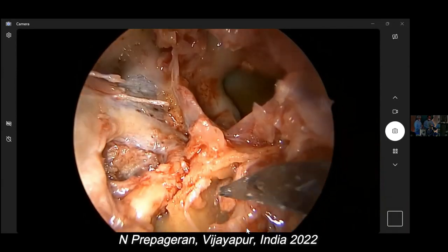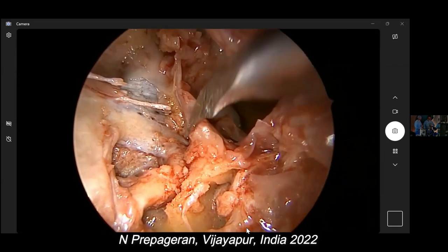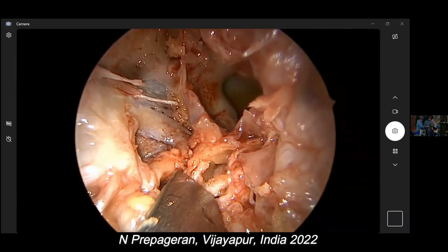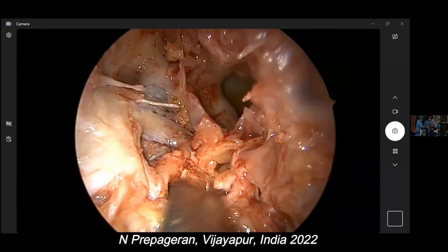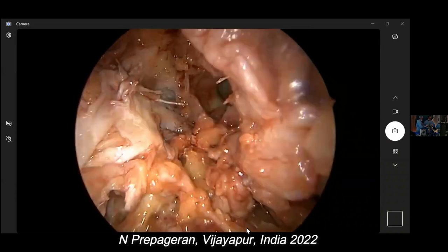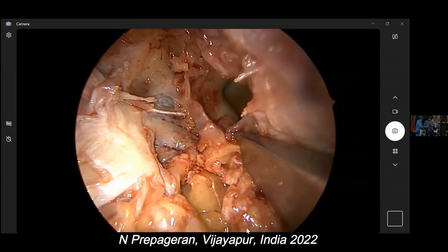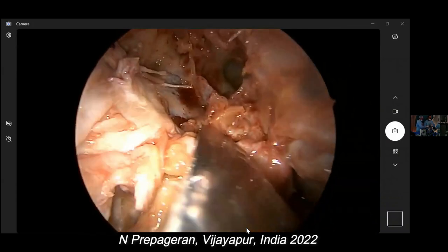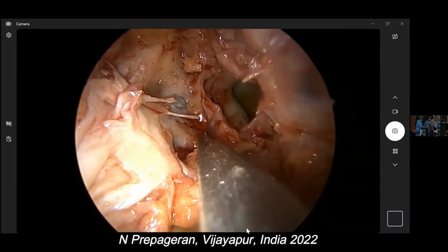Okay, V2, and if I remove this bone back, that's Meckel's cave. Chisel? This uncle is a tough guy. See, he's bleeding from the cavernous sinus, guys. That's the cavernous sinus bleed.